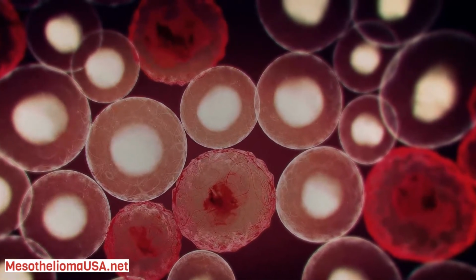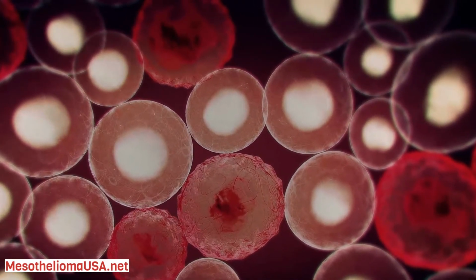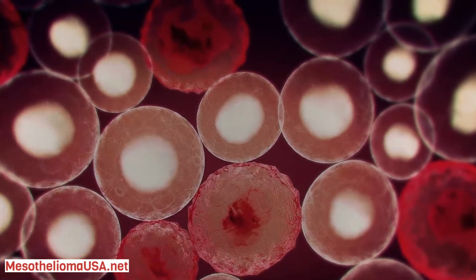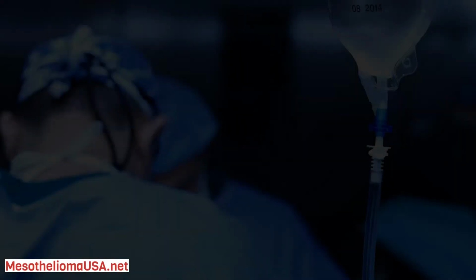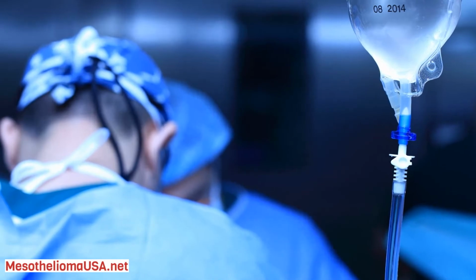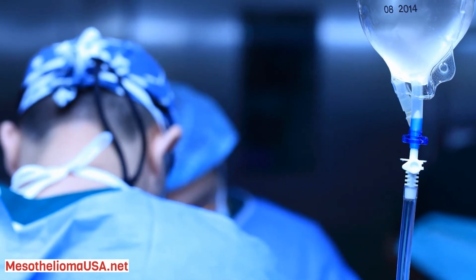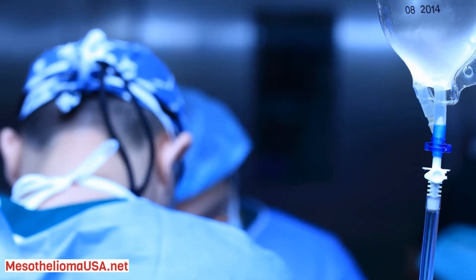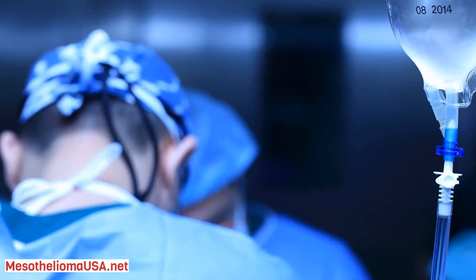Sinha et al., in their study in 2000 on 117 mesothelioma patients, reported that pleural effusion, 89%, pleural thickening, 82%, mediastinal pleural involvement, 66%, and thickening of the interlobar fissure, 53%, are the most common CT findings in mesothelioma patients.